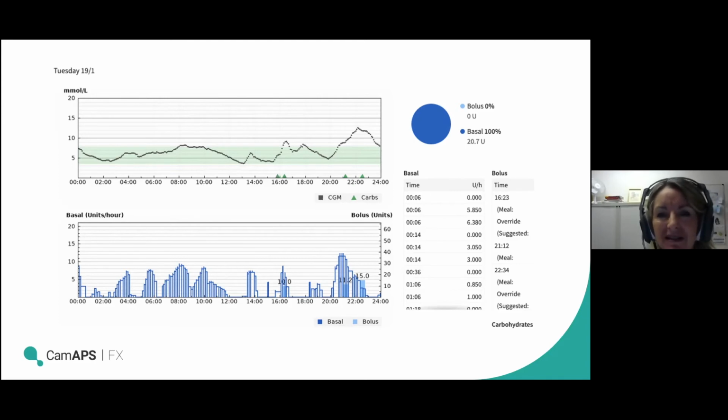So not needing a sliding scale, just keeping mobility and being able to move around, go and see their babies if they are in NICU. This baby thankfully was healthy, at normal weight, normal blood sugars, and was able to stay with his mum. So she was able to get breastfeeding initiated.